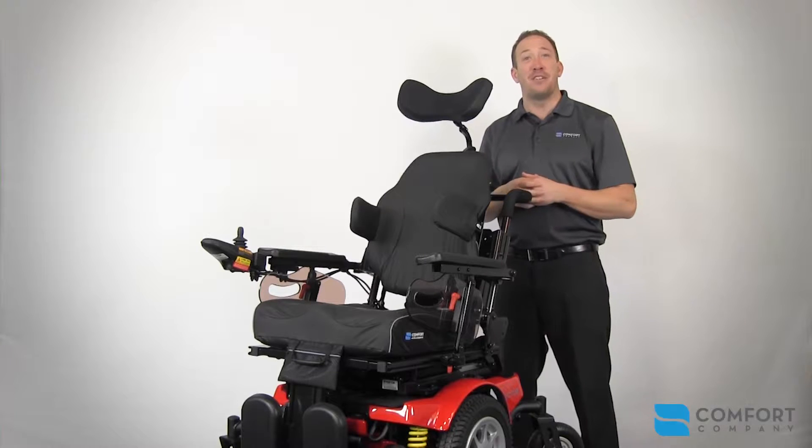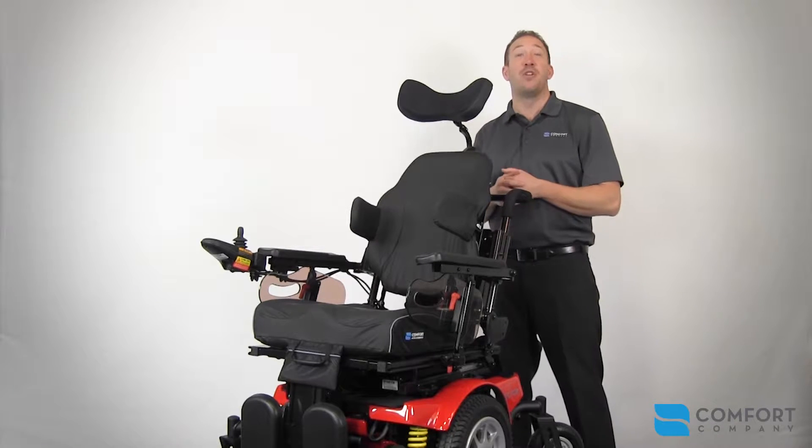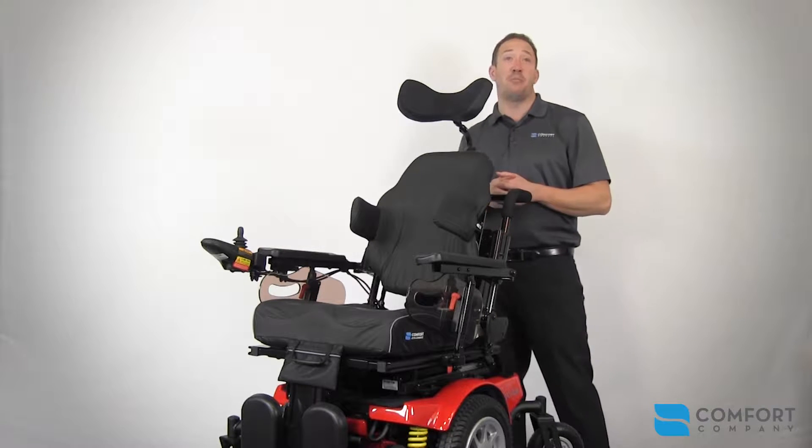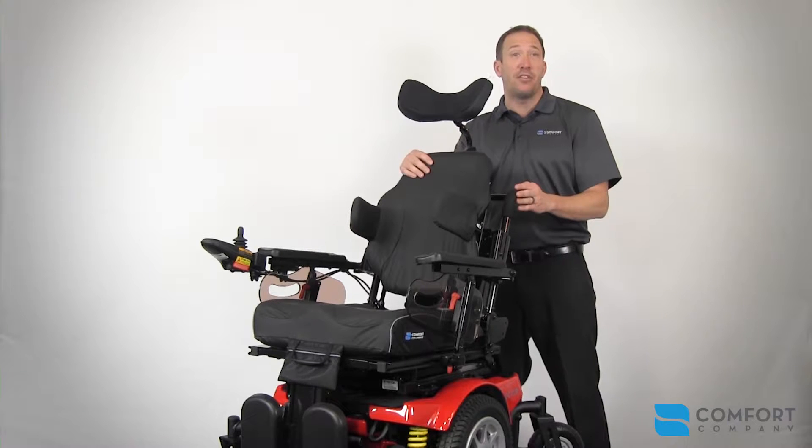Hi, I'm Steve Dufresne, the Vice President of Product Development at The Comfort Company, and I'm very pleased to introduce to you the newest OEM integration project between Avid Rehab's mid-wheel drive Vector Power Chair and our Comfort Seating Line.